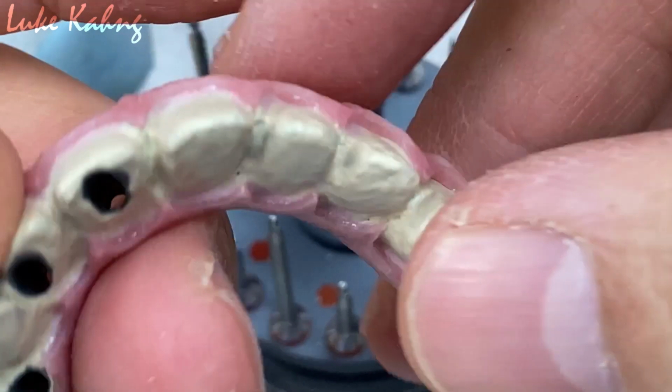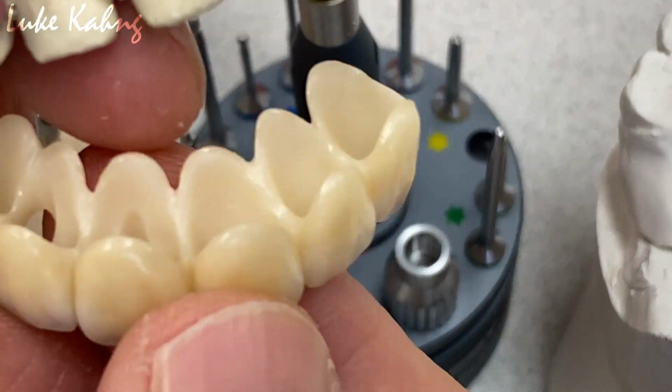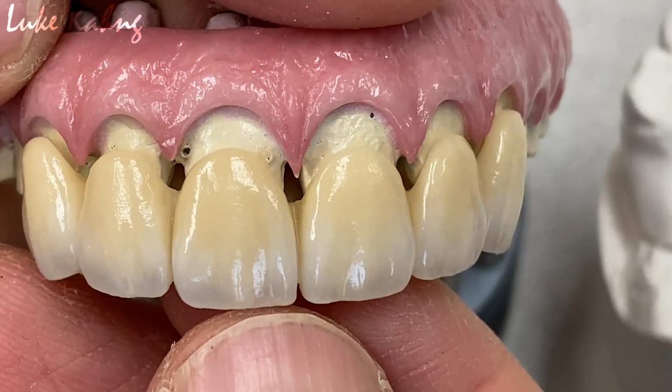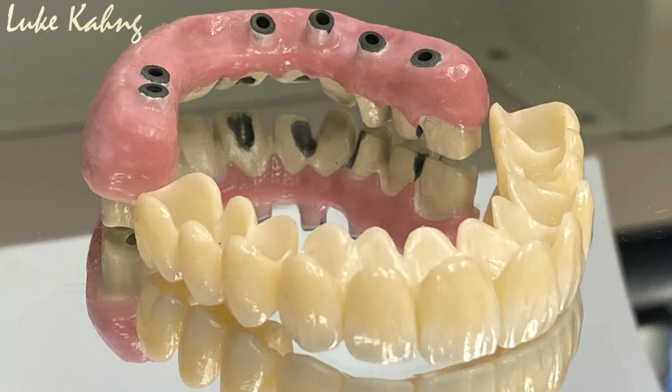And then on top of that, we will pack it. And then we finish the aesthetic restorations to make the individual look as natural as possible. We just finished one. It's like that.